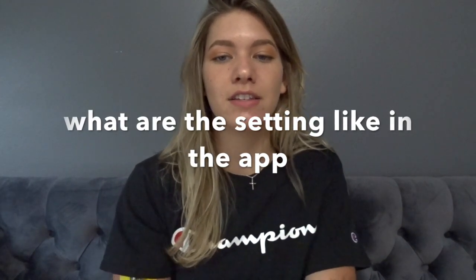So those are the basic questions about Loop, except for, let me answer, what are the settings? The settings are the exact same as you would have for your PDM. If you're on the Omnipod, you have the carb ratio, insulin sensitivity, correction factor, basals, everything. Honestly, the only thing I had to change when I started looping was my insulin sensitivity. Instead of 40, I made it 50, but all my other settings have stayed the same. My carb ratio changed by 1, and all my basals have remained the same.